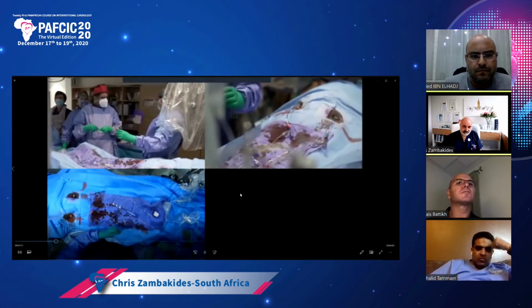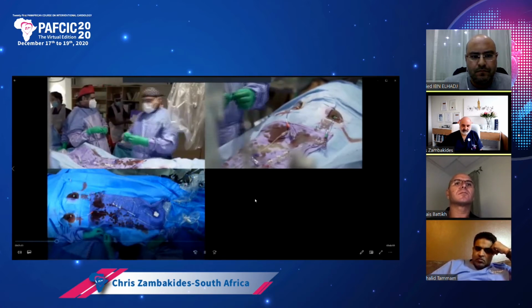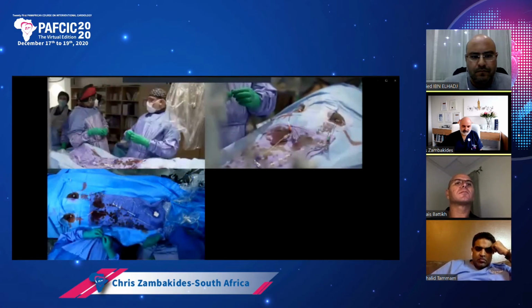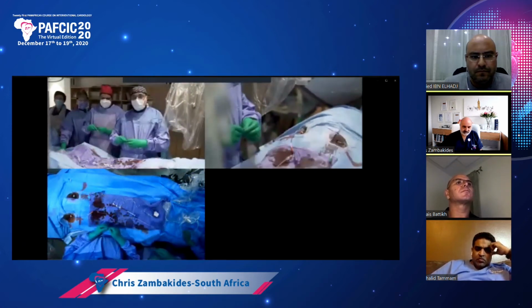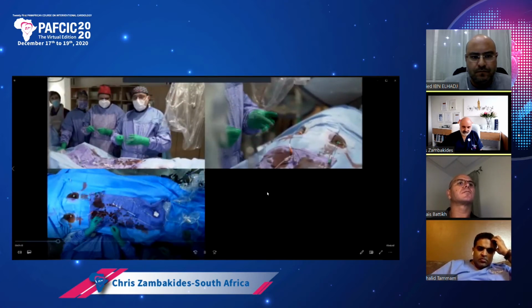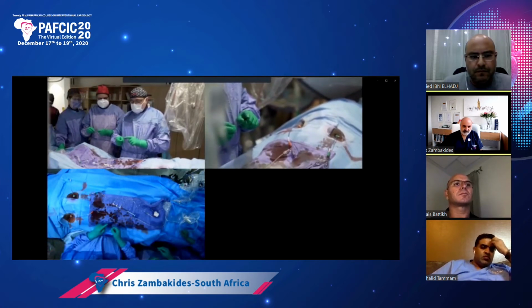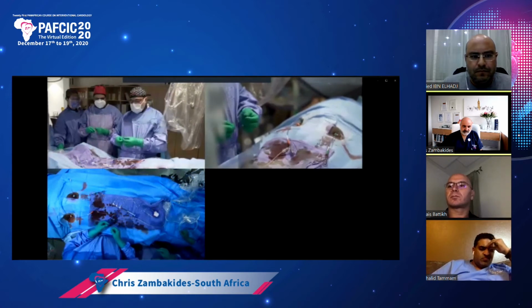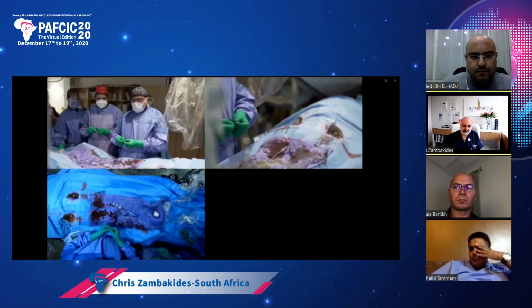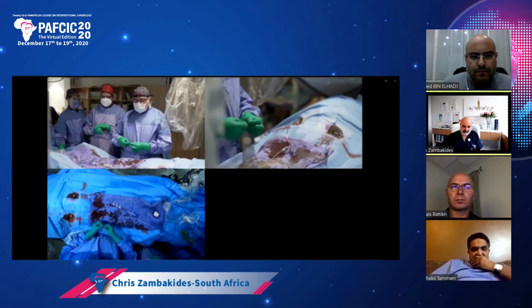So if you have a look, it's the Asahi Corsair Pro XS, the thinnest microcatheter currently on the market. The other good thing about it is, whereas before the Caravelle, which was also quite thin, had a tip that sometimes used to disconnect if you torqued it and it would grip, this one's got a shorter tip, and you can actually get a lot of torque out of this, and the tip won't disconnect. So it's essentially a very, very thin Corsair.